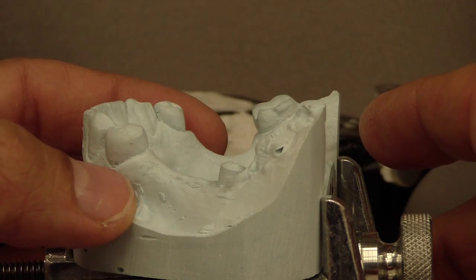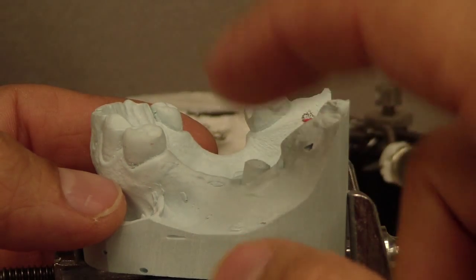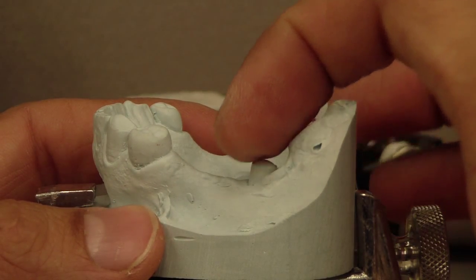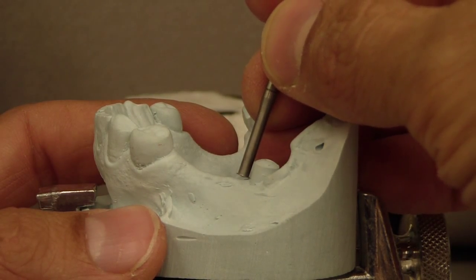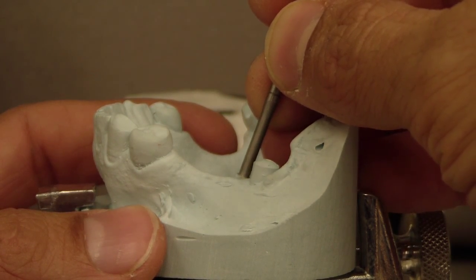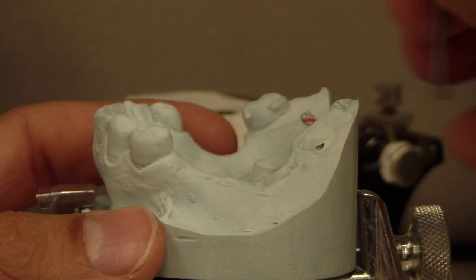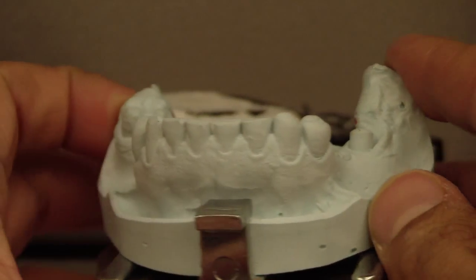We're not using an I-bar because we don't have tissue displacement. We're just going to be placing this acrylic on top of this. The intention of the framework is to stop approximately here, and this is actual tissue. So, guide planes, that's it.